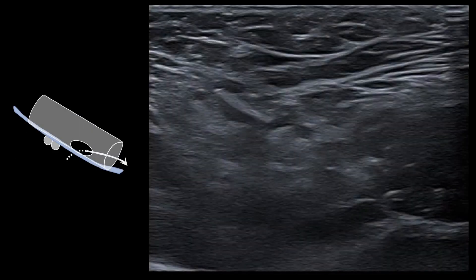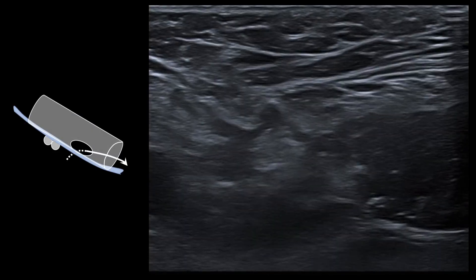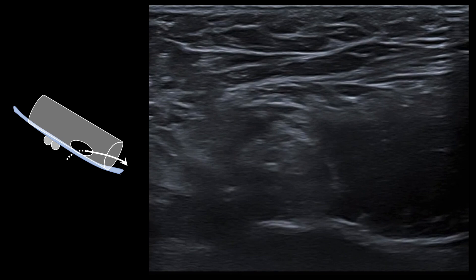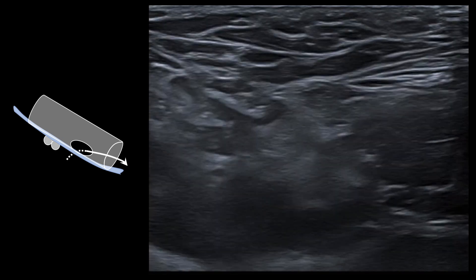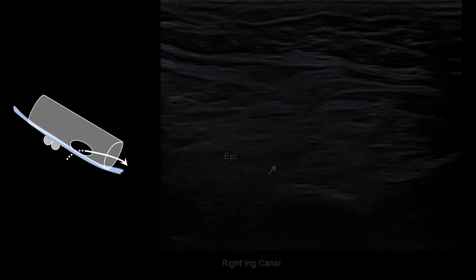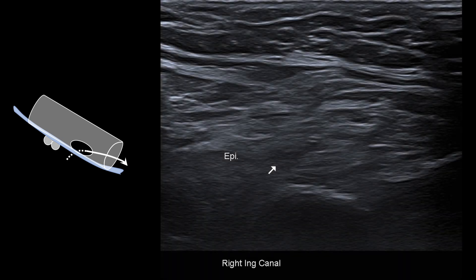In this case, we once again see fat moving through the canal, with the defect arising medial to the epigastric, consistent with a direct inguinal hernia.